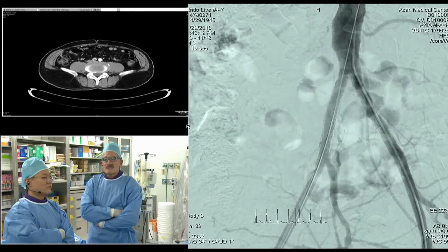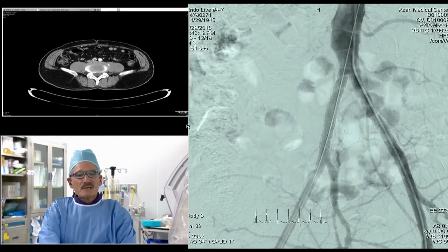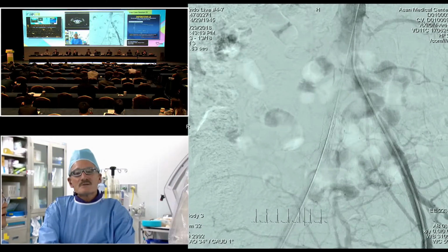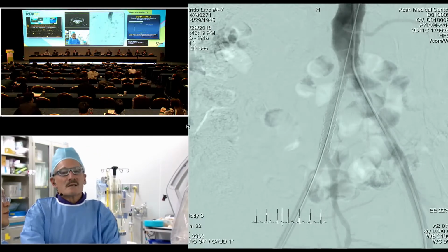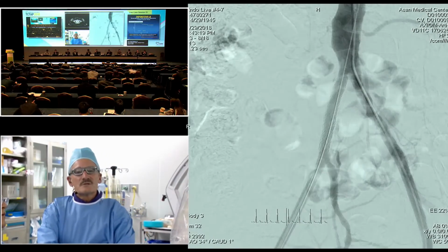If you look at our recent appropriate use criteria for the iliac, published in the past 6 months, the ISR lesions, TASC C and D, and CTOs are all indicated. And of course, if you're performing re-entry, it's advisable if you're having to re-enter into the aorta.